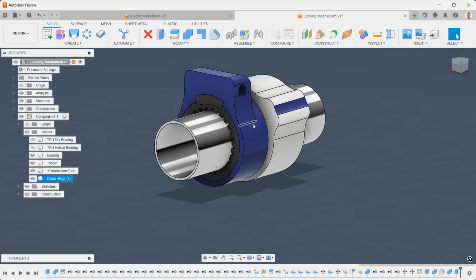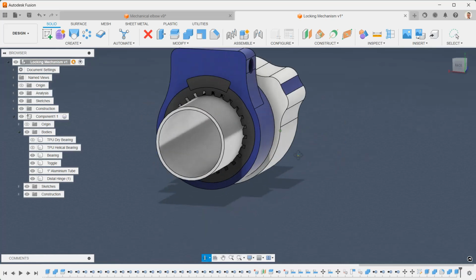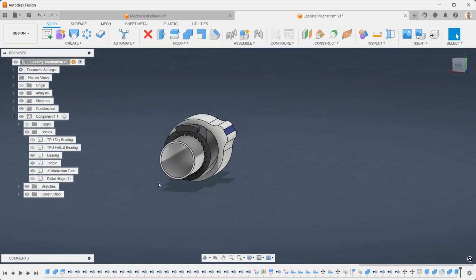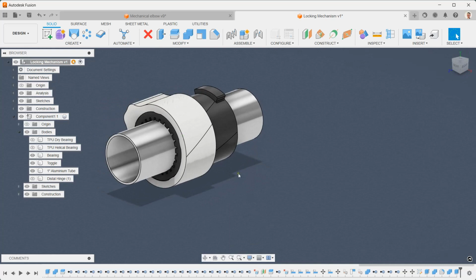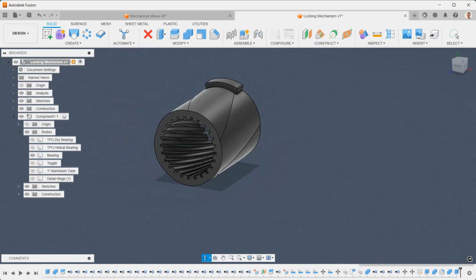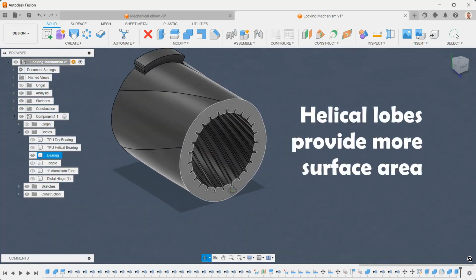Because that's not going to be the case now, I mean, it's barely discernible that you've actually got any lobes there at all, so it would probably just rotate around on the spot. So I've just put this little lug here, which recesses into what I'm calling the distal hinge. Another change as well is that the lobes themselves are also helical. So we've gone for helical teeth and helical lobes.